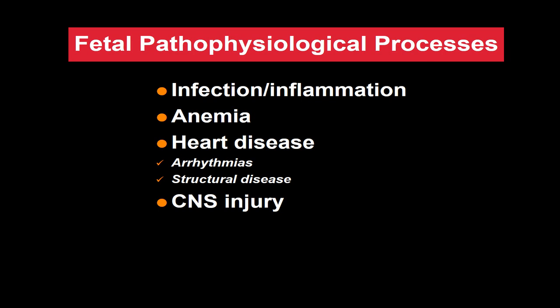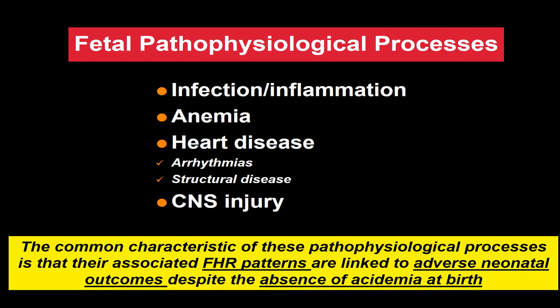The fetal pathophysiological processes include fetal infection and or inflammation, fetal anemia, fetal heart disease, and fetal CNS injury. The common characteristic of these pathophysiological processes is that their associated fetal heart rate patterns are linked to adverse neonatal outcomes despite the absence of acidemia at birth.